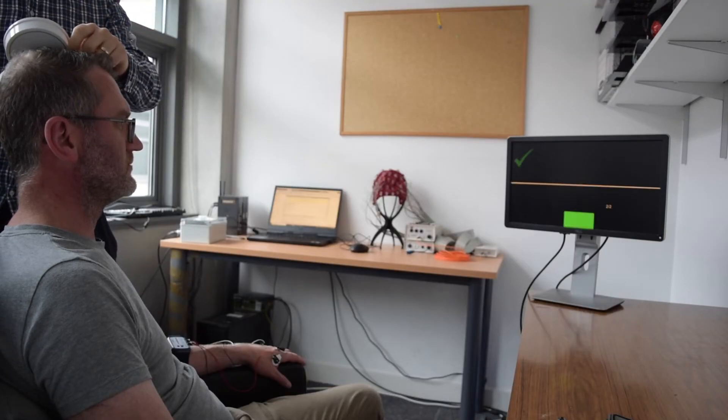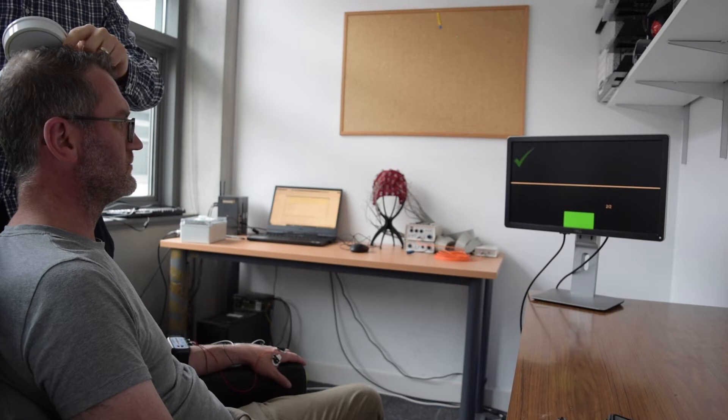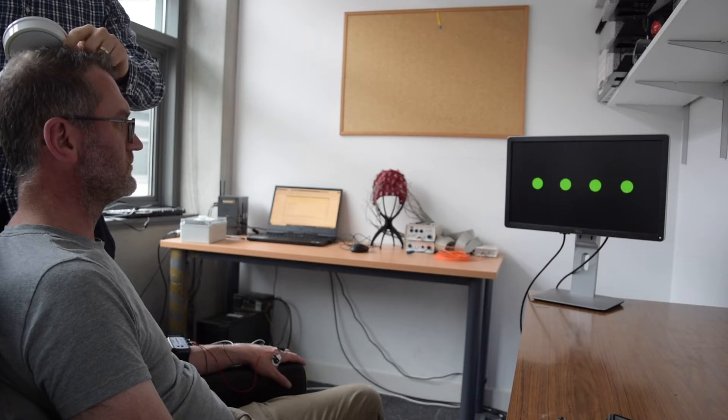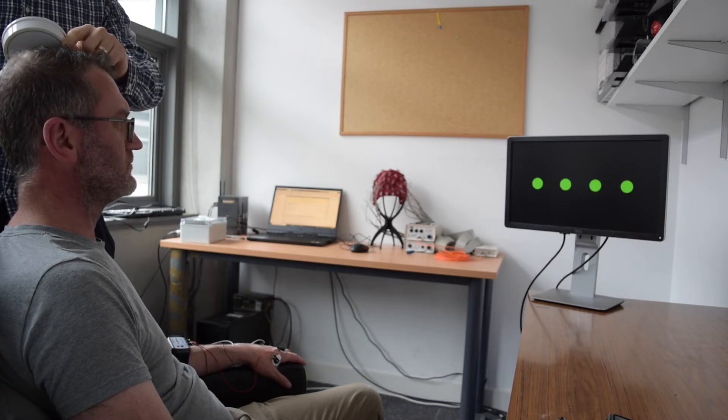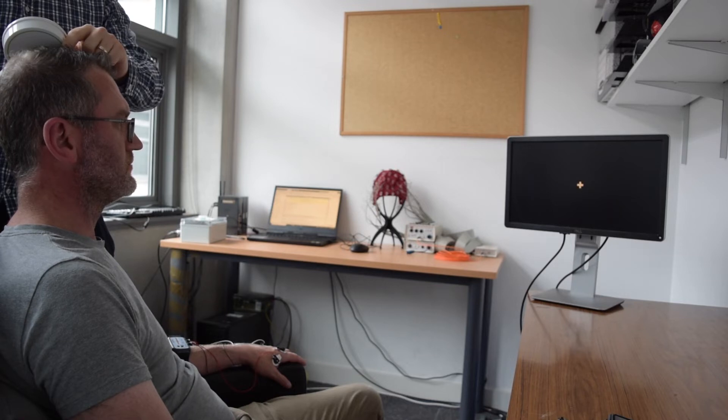The training to learn how to control this BCI involves multiple trials of single pulse TMS with close to real-time feedback of the amplitude or size of the MEP that just occurred.